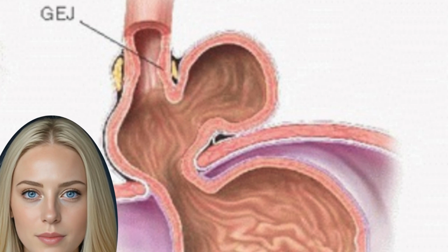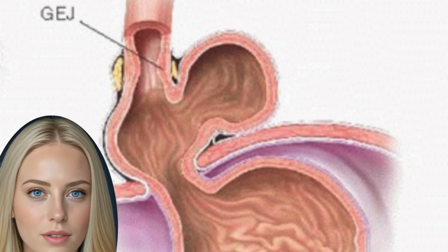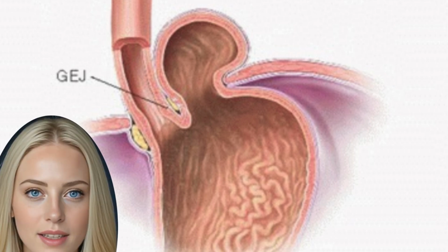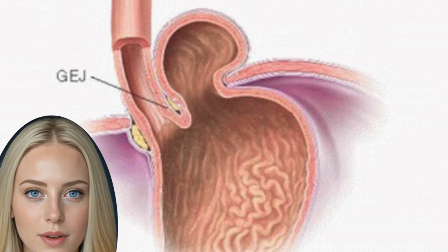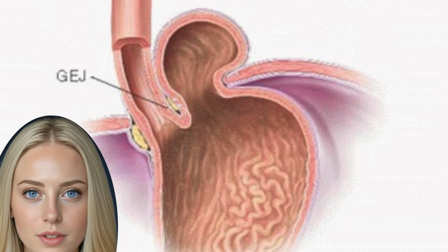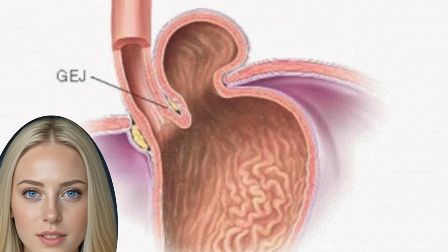Upper endoscopy. All preoperative patients should undergo upper endoscopy if possible. By visualization of the esophageal and gastric lumen, neoplasm, Barrett's esophagus, and esophagitis can be biopsied, and, in case esophagectomy is warranted, provide histologic diagnosis. Furthermore, anatomic landmarks can be seen, such as the distance between the hiatus and the GEJ, as well as the size of the hiatal hernia.